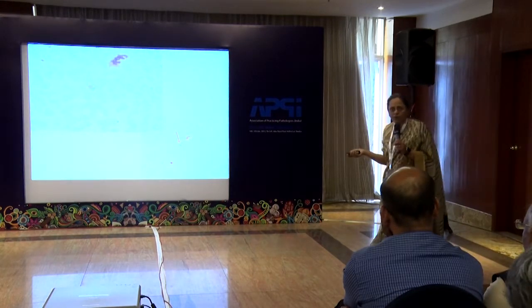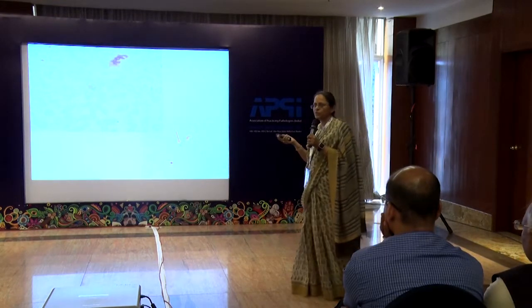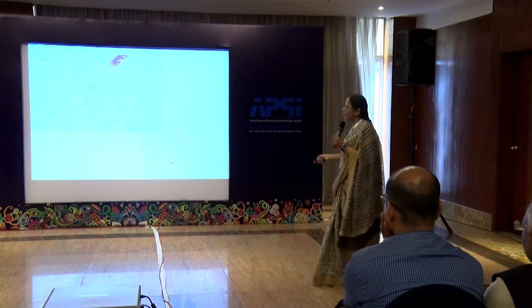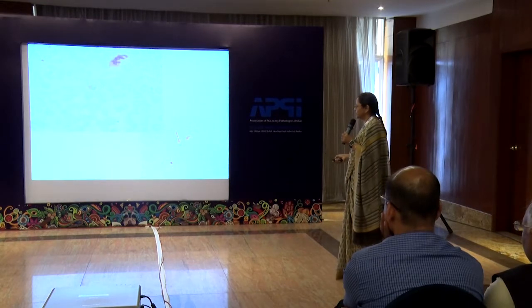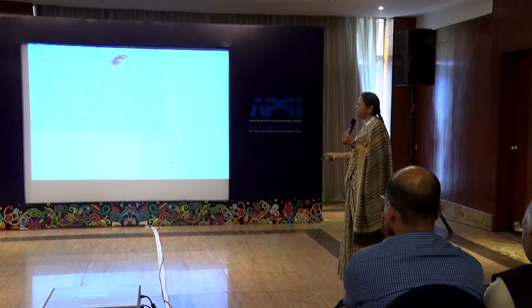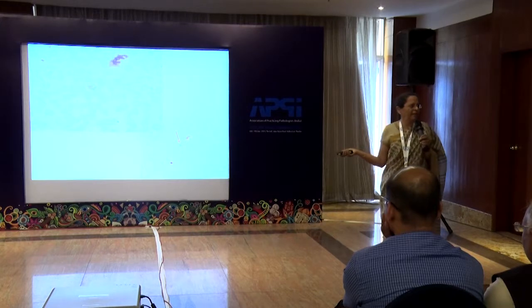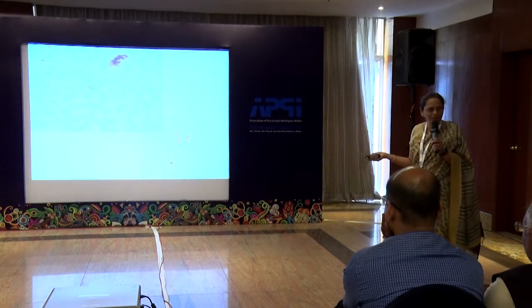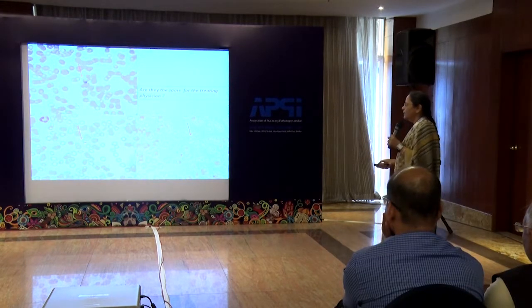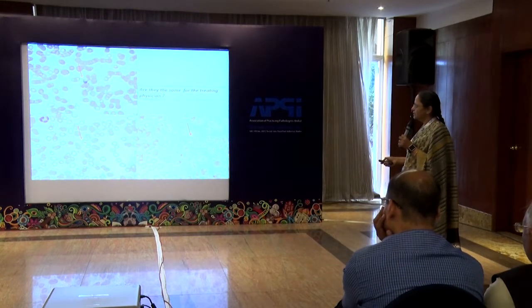Well, I do not yet trust, although I keep reading papers and I keep looking at posters in conferences that say MP can be detected by the cell counter. I don't know if it would pick up this. I picked it up at a low magnification, and sure enough, it is a vivax malaria, and we could make a diagnosis. I don't know if my cell counter would have done it. My 5-part too.